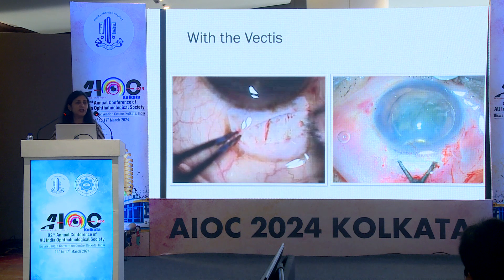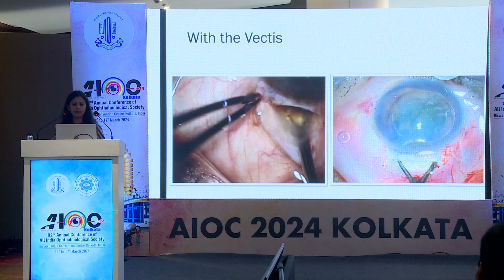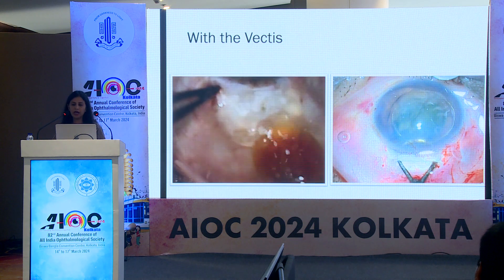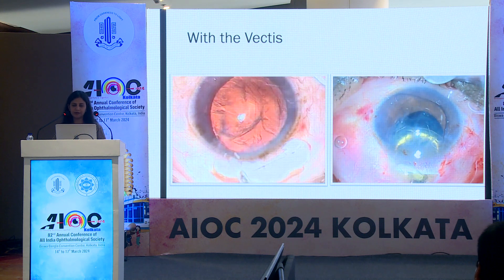Another way of using the vectus: after filling the anterior chamber with viscoelastic, the vectus is inserted underneath the nucleus. The nucleus is then delivered by gentle depression of the scleral lip with the non-dominant hand while pulling the superior rectus. Here is another video demonstrating the same technique.